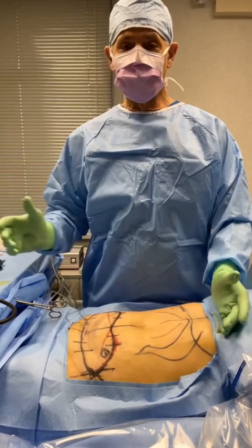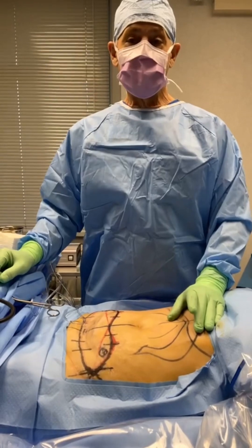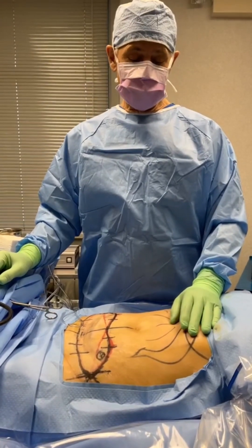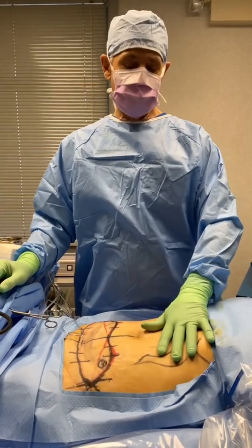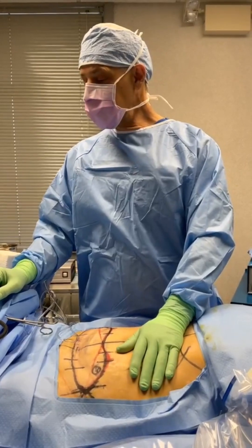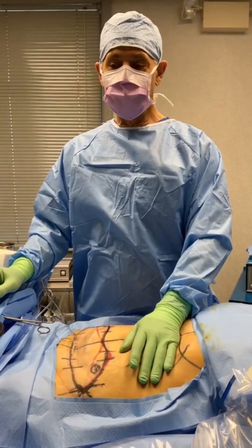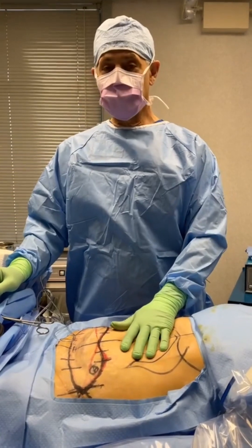Then we're going to suction out those fat cells that we bounced off with the VASER. After that, we're going to use Renuvion, which is plasma energy, to give a tightening treatment to all of this area of the abdomen. And then I'm going to do what's called an HTLA-style abdominoplasty, or tummy tuck.